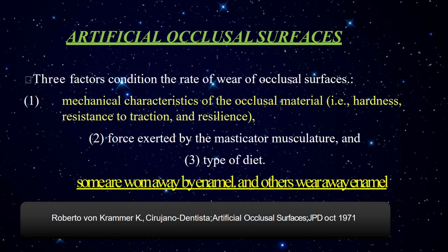Wear and its management. Some amount of occlusal wear of the denture teeth is expected due to it opposing a natural dentition or a fixed partial denture or ceramic dentition. So some amount of artificial tooth wear is inevitable.